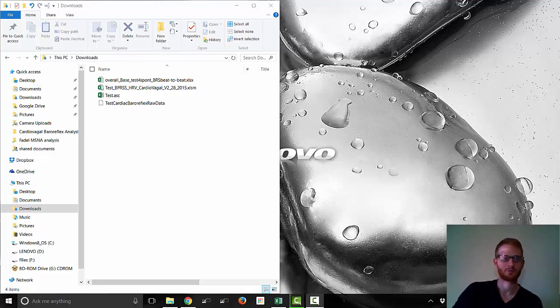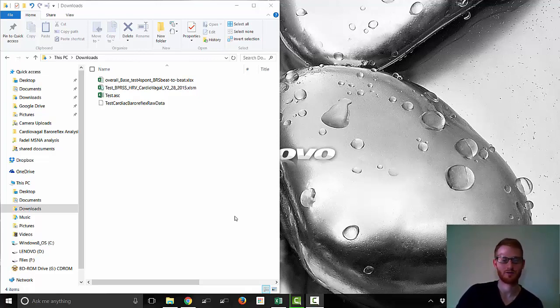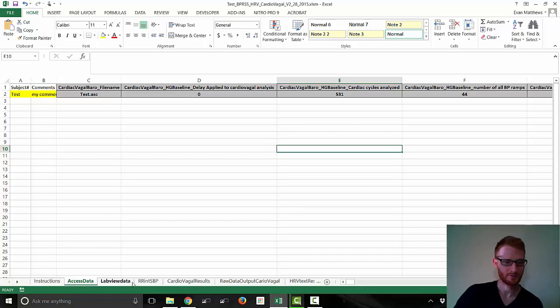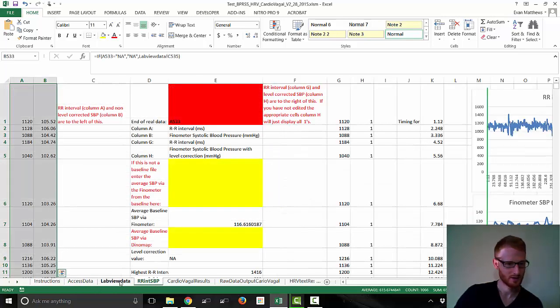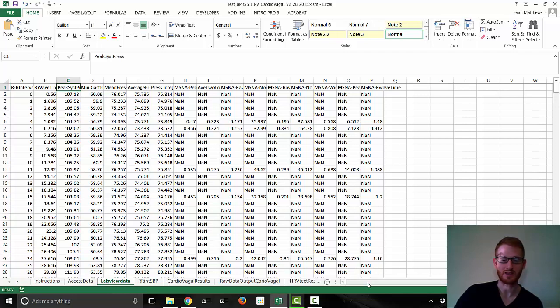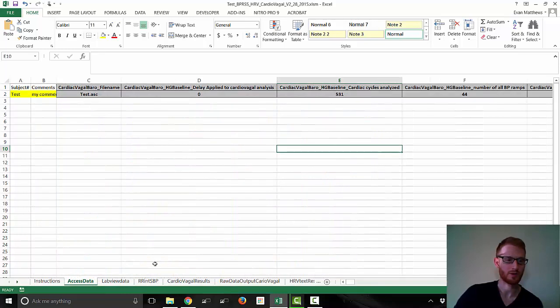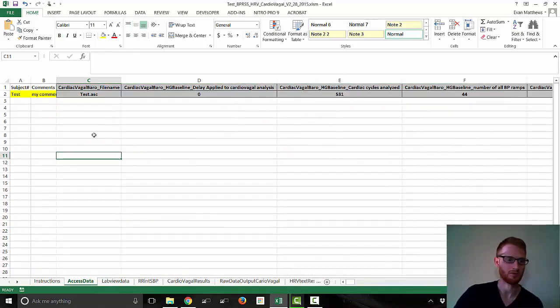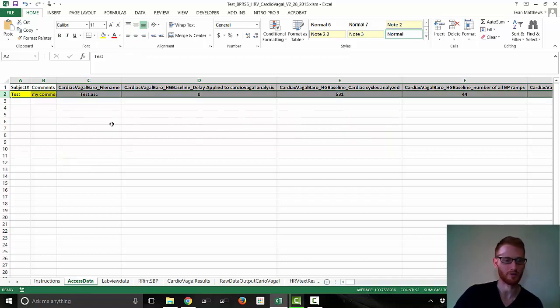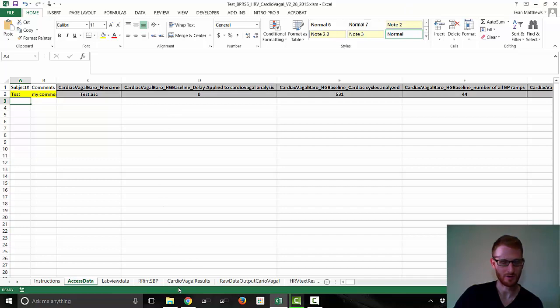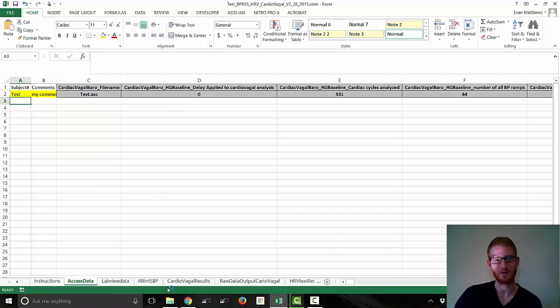All right, so in this video I'm going to continue with what I showed in the cardiac baroreflex video, which was how to get from this raw data from our LabView program to a point where we have our cardiac baroreflex data all together in a single row for this person. This time though, I'm going to be doing the heart rate variability, and I'm going to be doing this using Kubios software.